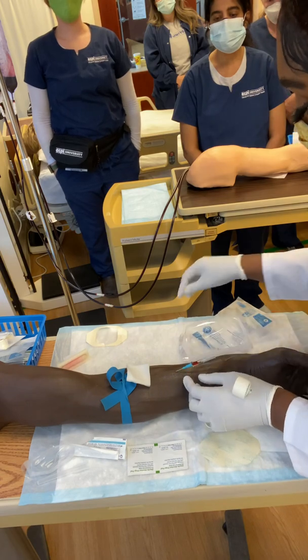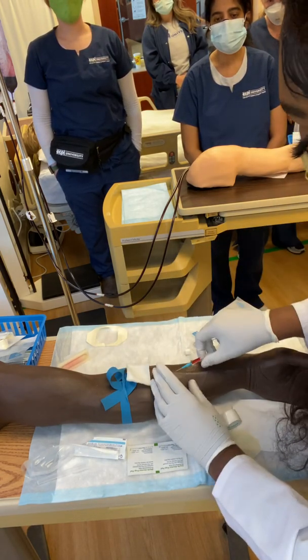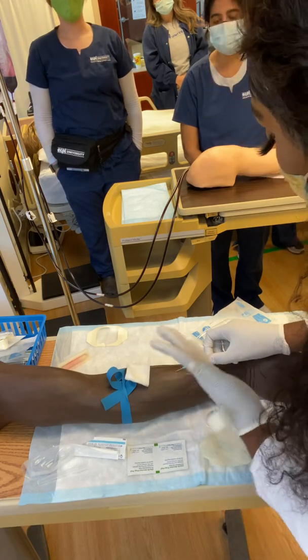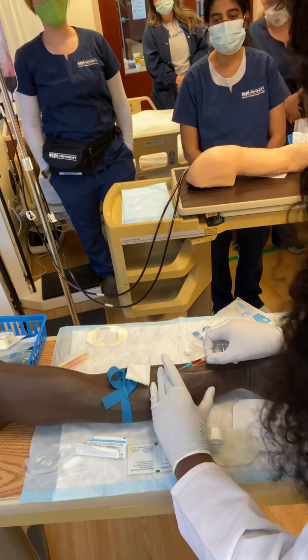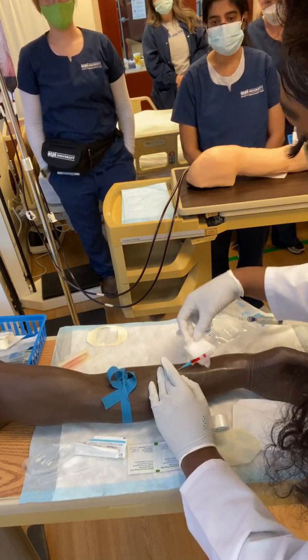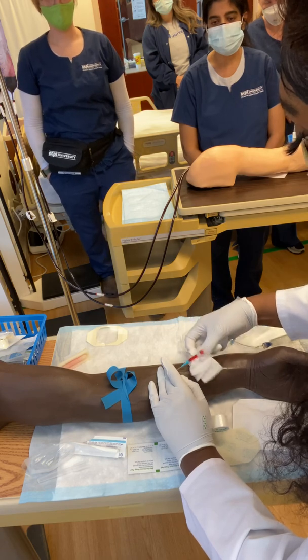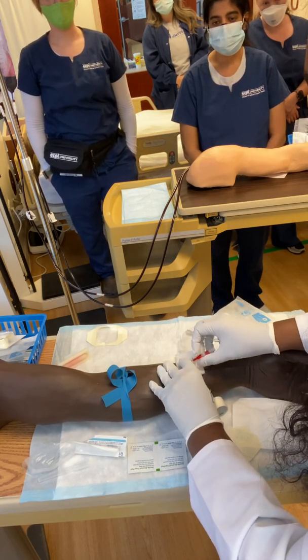Perfect. So what we do now is we get our stuff going right here, and you see how it backs up in there and you can just have a mess. So what I like to do is hold it right above. That'll help stop the blood. I like to put my little gauze right up under there to prevent any mess. And then we're just going to turn.